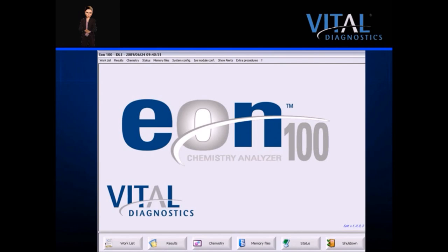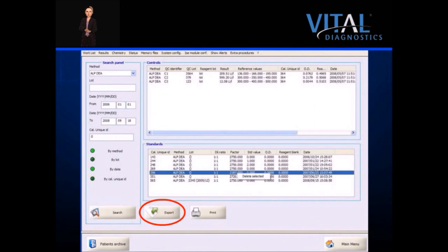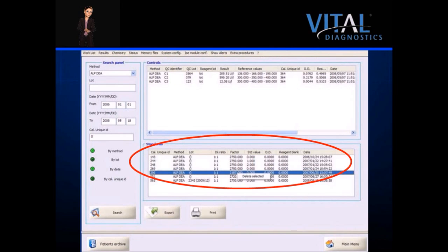All patient, control, and calibrator results are stored on the EON100 and are easily retrieved from the memory screen. Patient results are searchable by surname, ID code, date, method, or unique ID. Data can be exported by one click. The system stores between 9,000 and 15,000 patient reports depending upon the number of methods run per patient. When maximum capacity is reached, the oldest data is automatically archived. Controls and calibrators are searchable by method, lot, date, or unique calibrator ID, and the system stores up to 8,000 calibrator and control records.